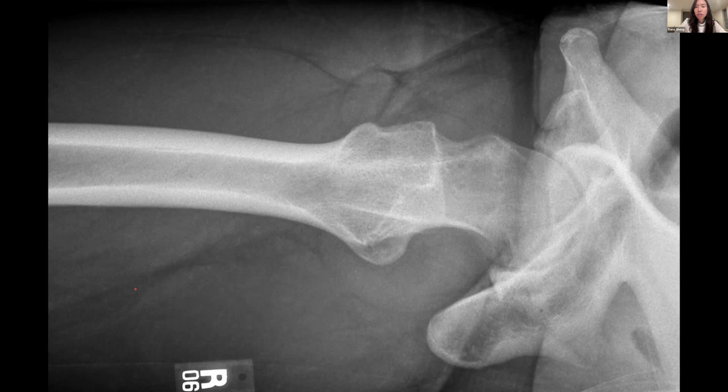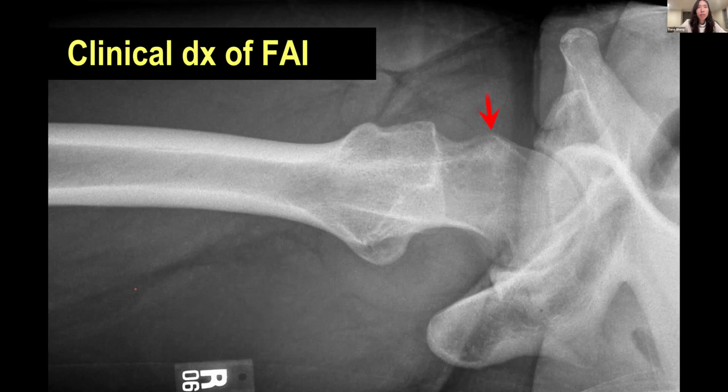Thank you. You showed us a good example of a bisphosphonate-related atypical fracture in a femur. Is there a similar spot around the knee that you've ever seen those in? I don't know about bisphosphonate-related fractures per se.